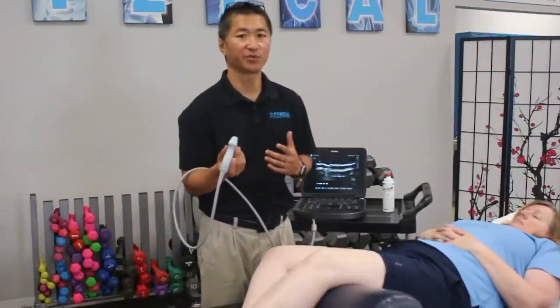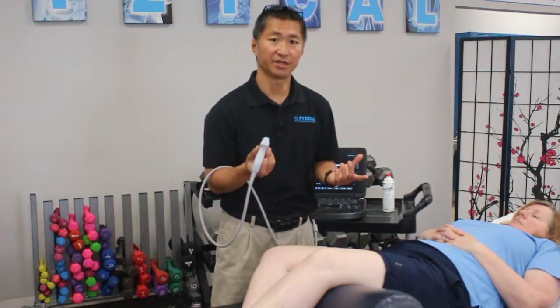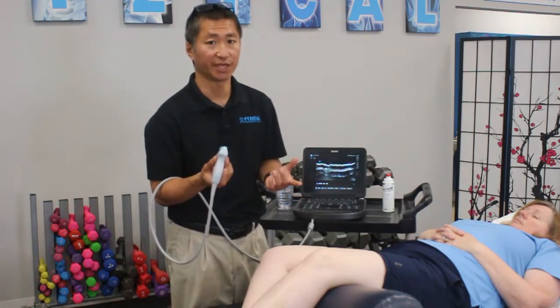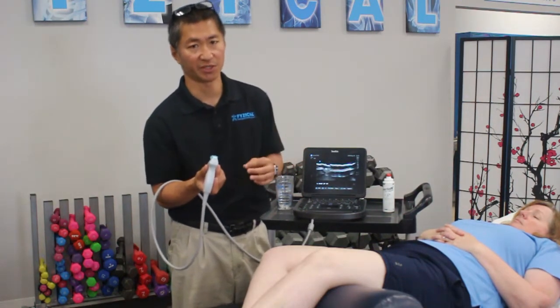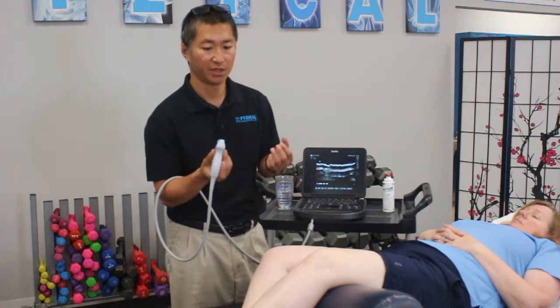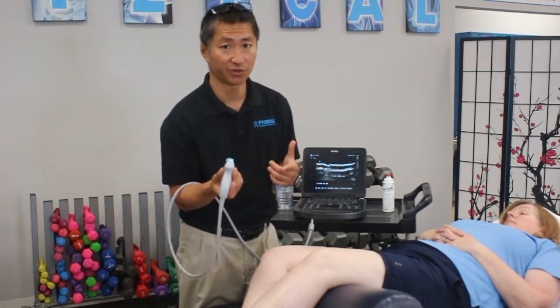Okay, so one of the first things we want to determine is the extent of the injury, whether she actually has any ligament tears, any strains, and the way we're going to do that is with some ultrasound imaging. So as you can see, we have an ultrasound tool here that allows us to look into the soft tissue, look at the ligaments, the meniscus, the tendons, and see exactly what's going on. So we're going to do a live ultrasound, and then hopefully we'll show you the results once we get done.